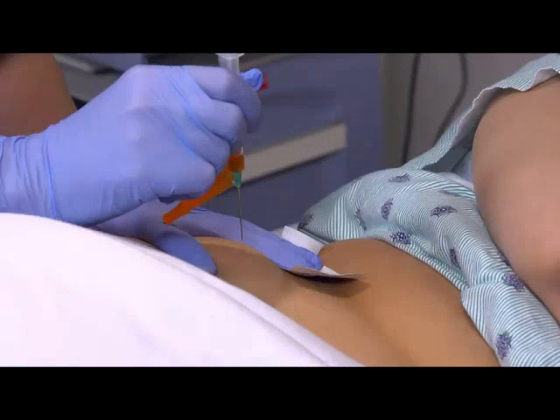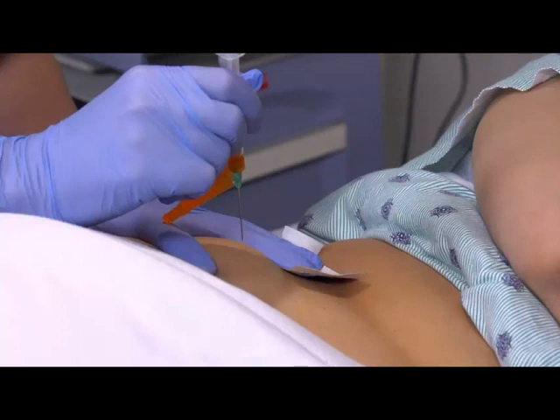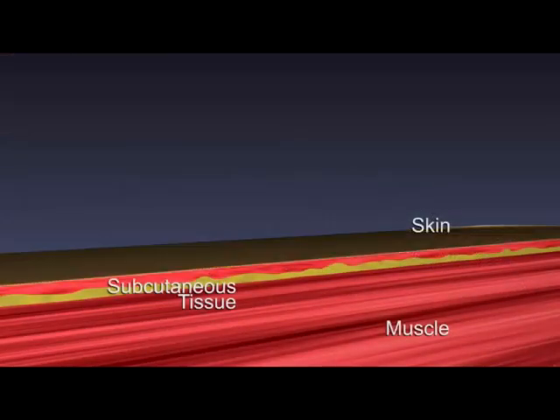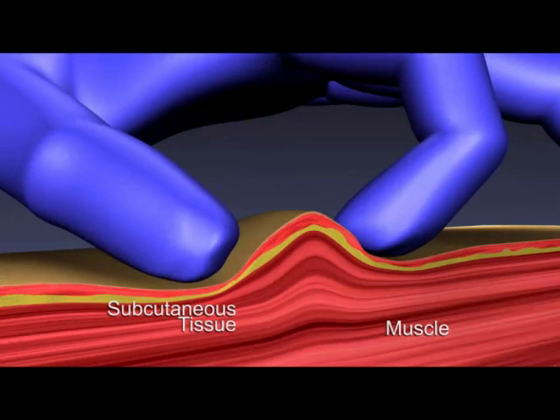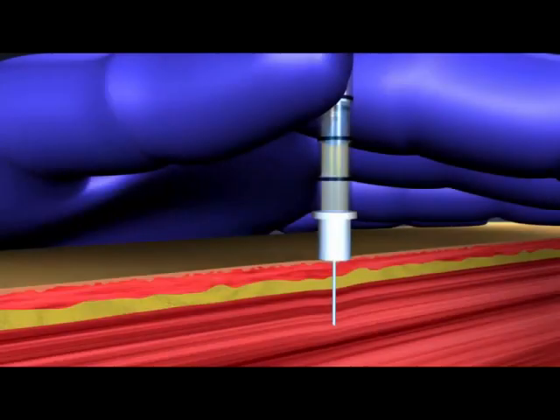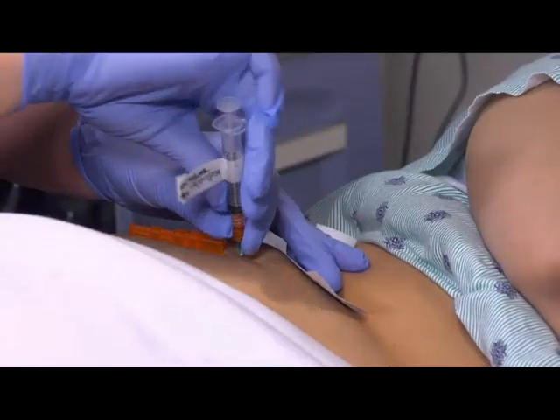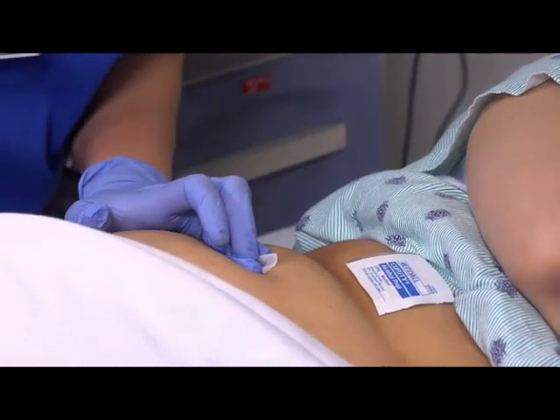Hold the syringe with the thumb and forefinger of your dominant hand as if it were a dart. Remind your patient to try and relax. Place the ulnar side of your non-dominant hand just below the injection site and pull the patient's skin laterally about 1 to 1½ inches or 2½ to 3½ centimeters. Hold this position until you've inserted the needle. If the patient has little muscle mass, grasp the body of the muscle between your thumb and forefinger. With your dominant hand, quickly pierce the muscle at a 90-degree angle to the skin. Inject the medication slowly at a rate of 1 milliliter every 10 seconds. Wait 10 seconds and smoothly withdraw the needle, then engage the needle safety.